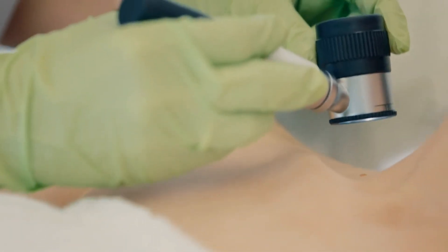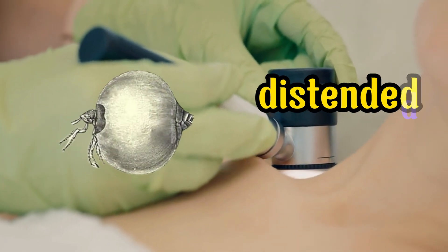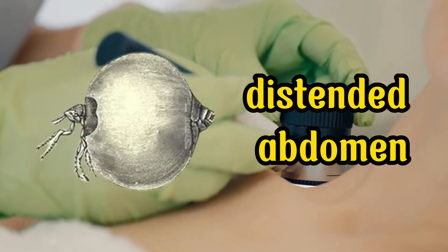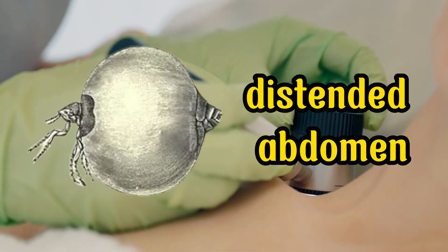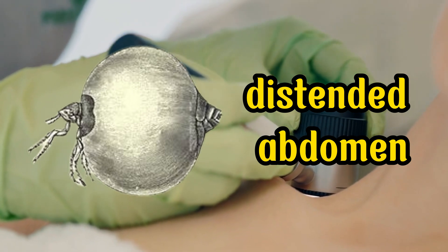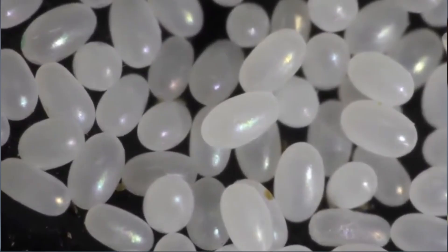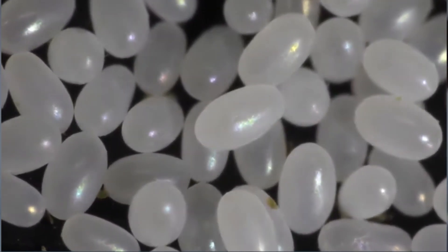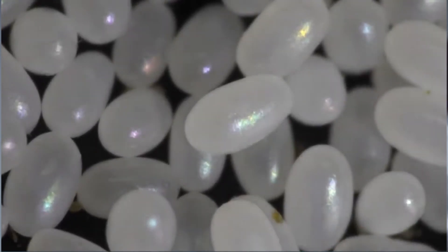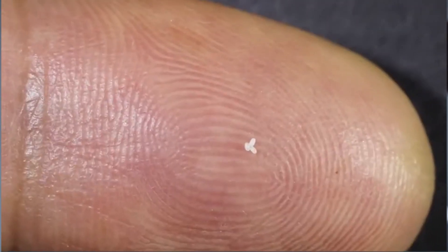Ex vivo dermoscopy is a technique that involves the examination of the extracted sand flea, especially its head and distended abdomen, under magnification. This method provides direct visual confirmation of the parasite's presence and its reproductive status.